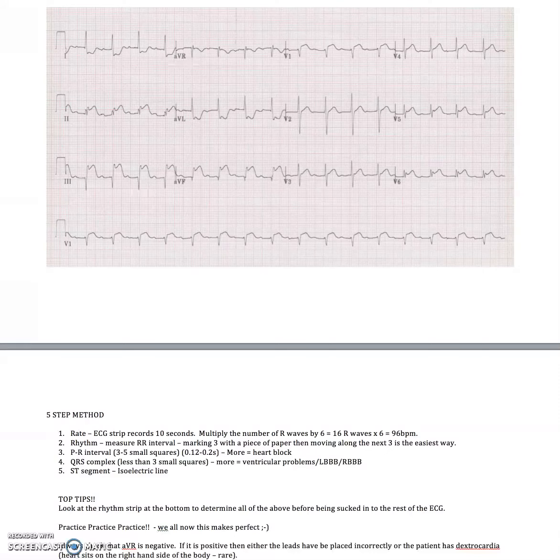They are made out to be very complicated by the textbooks and the literature out there. They're really not that complicated if you break them down slowly and in little pieces and follow a structured method to interpreting them. So I'm going to try and make that as easy as possible for you. If I do miss anything or you're unsure of anything, then please do ask questions either on the messages below this post, or you can send me a private message.